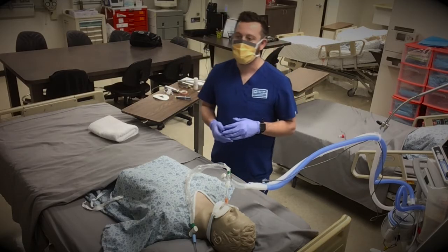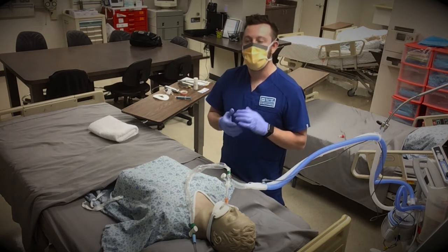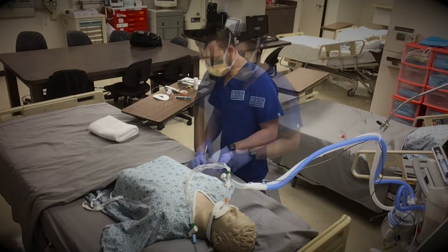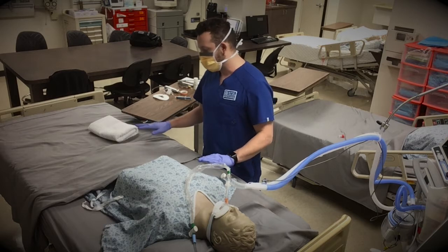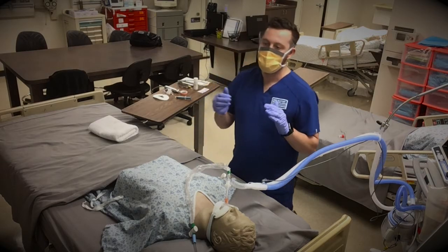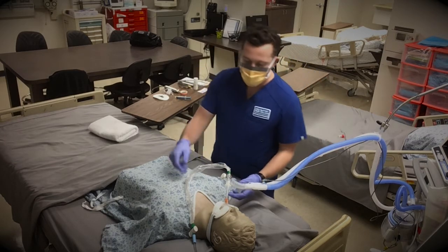Now, let's get into how this procedure is to go. The procedure for oral tracheal extubation is as follows. Prior to extubating your patient, the following should be done. Assess the room, assess the patient. So the equipment, what equipment do we need? We have a suctioning apparatus right here.